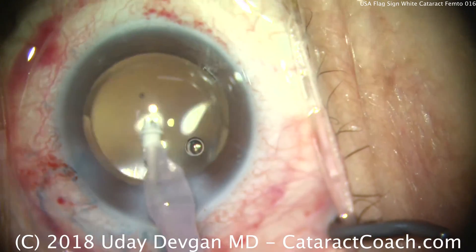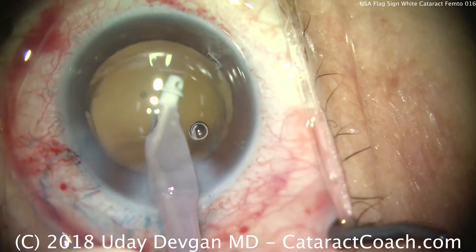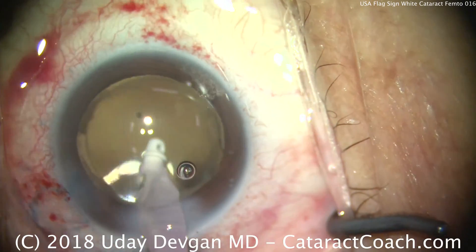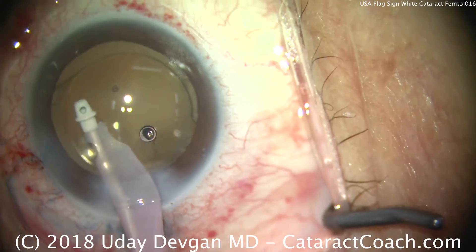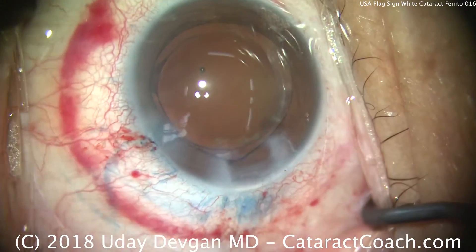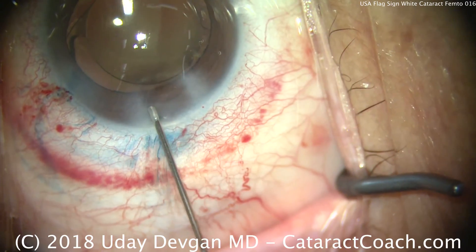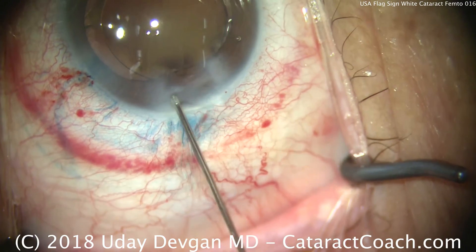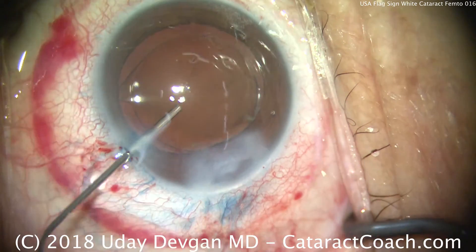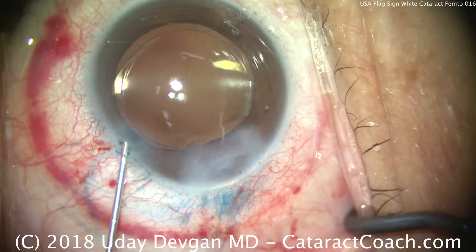Seal up the incisions and we'll be done shortly. Yes, you can certainly use a femtosecond laser to help do a capsulotomy in a patient with a white cataract — the beauty is that you don't need to visualize it directly, and you don't have the risk of the Argentinian flag sign. You're able to make the capsulotomy in about one second in a closed chamber. You'll still need the trypan blue if you wish to see the capsulotomy. Remember my USA flag sign: the red from the subconjunctival hemorrhage, the white from the white cataract, and the blue from the trypan blue — red, white, and blue, the American flag colors. Thank you guys for watching.